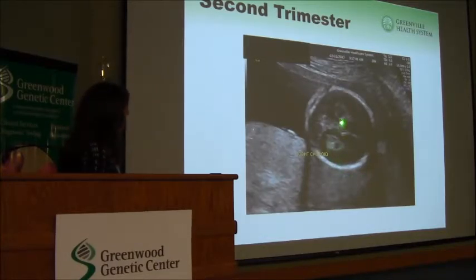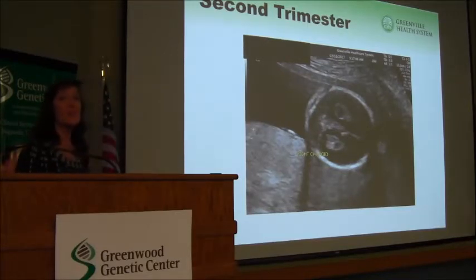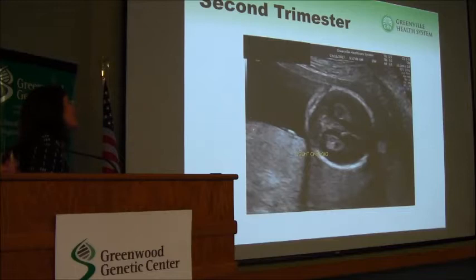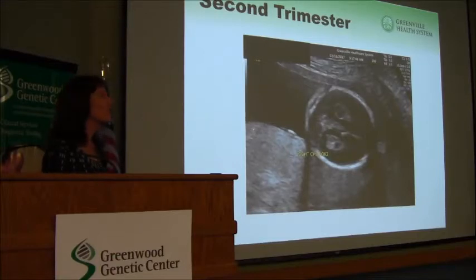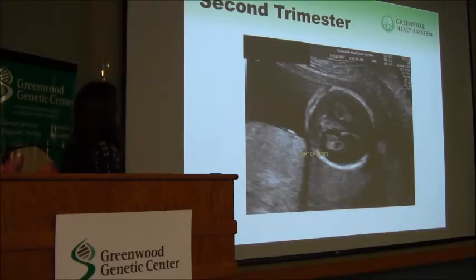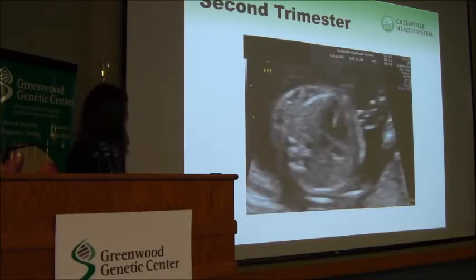This is a choroid plexus cyst. They do have an association with trisomy 18. We also see them in 1% of normal babies, so we have loved having cell-free DNA as a tool to reassure these patients, because when we see these in isolation, the risk is about 1 in 400 for trisomy 18, and having a normal cell-free DNA allows us not to have to do an amniocentesis on these patients.